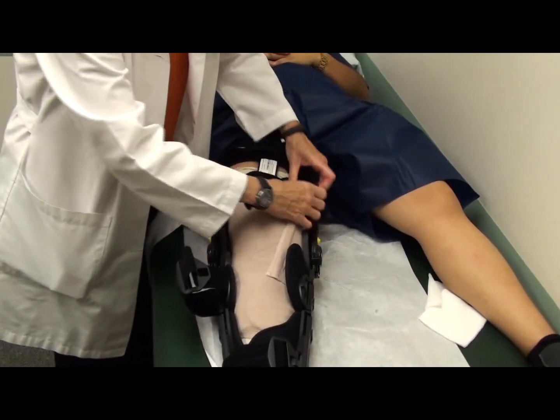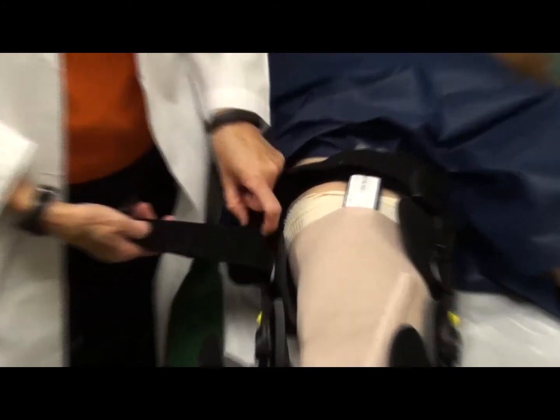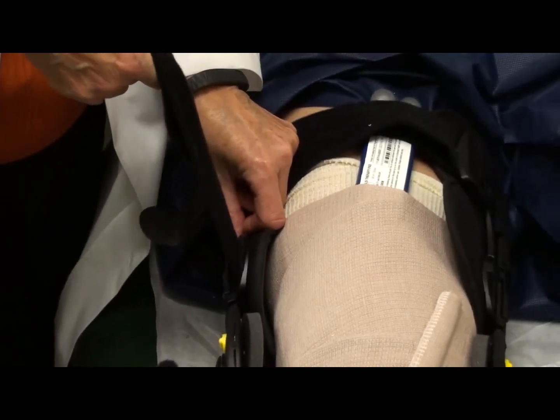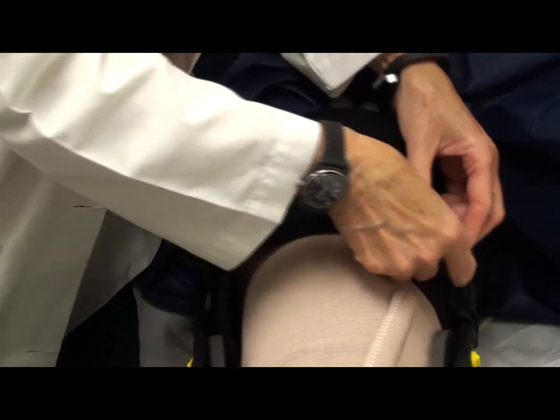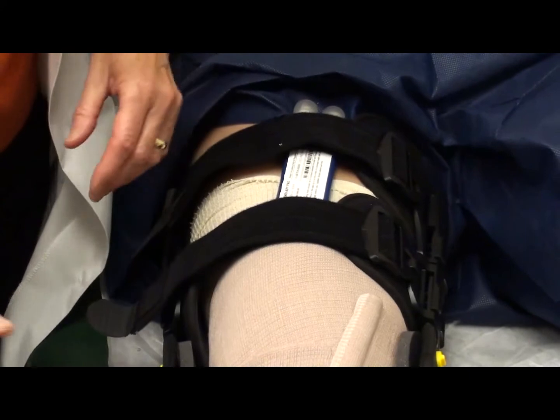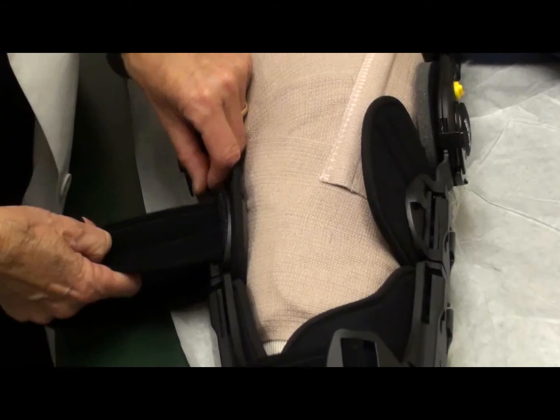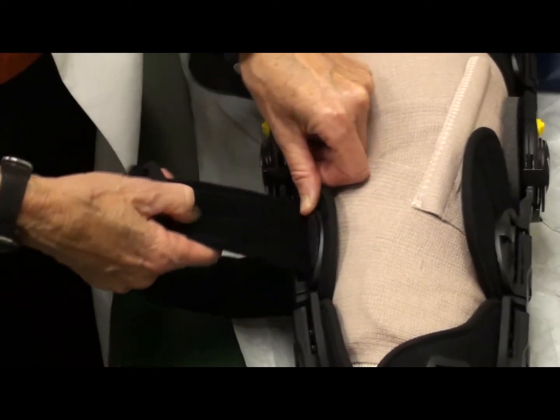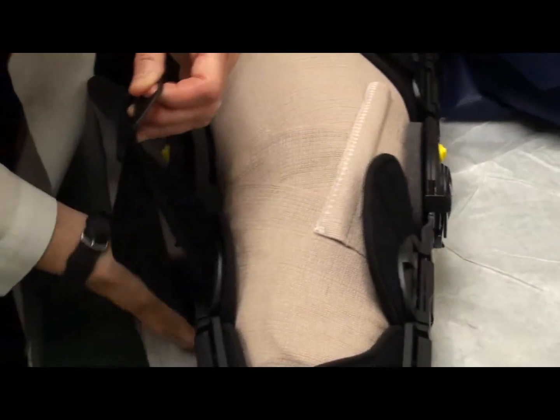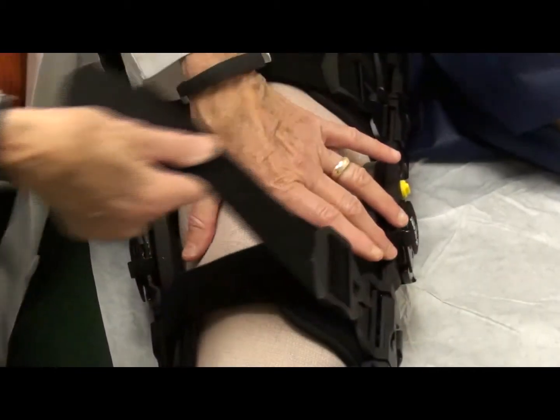So what I recommend is you unhook it. There's a Velcro piece right over here. You pull the strap away, and then you can pull it up from behind and tighten it in back first. And then lay it over, click it in, and then you can tighten it here. So I'll show you again on the lower one. Again, before you tighten the straps up, pull it back, disengage it from the Velcro on the side, pull up on it a little bit, give it a little tug, loosen your strap, put it on the front, and then you can tighten it here.